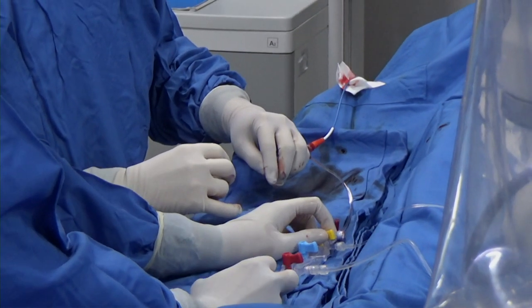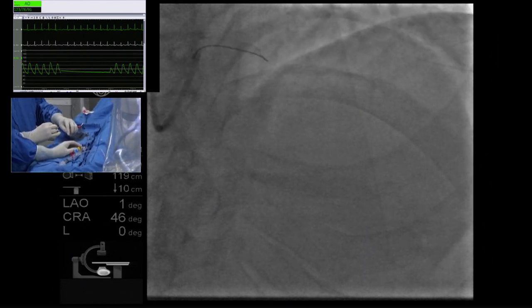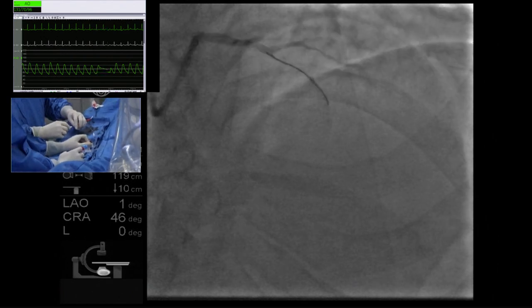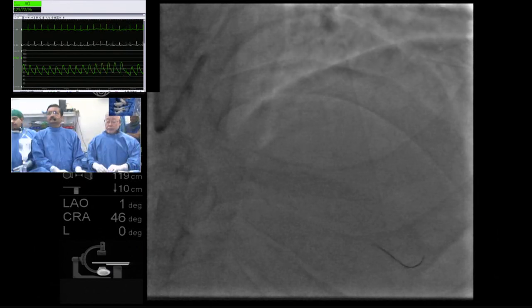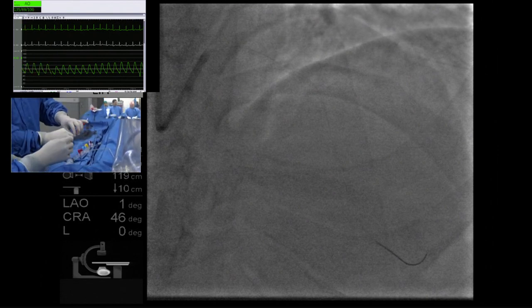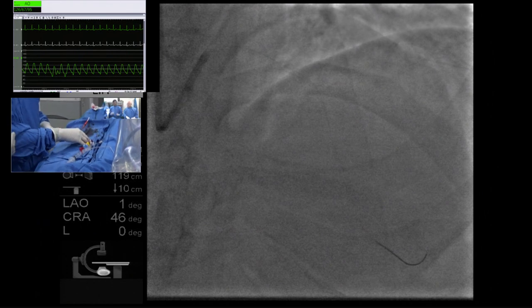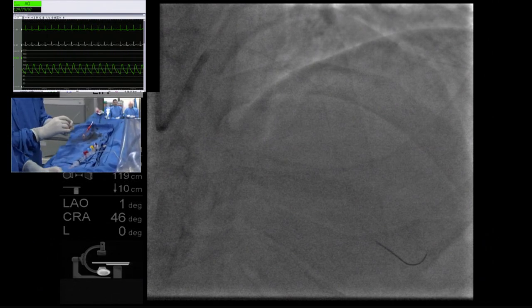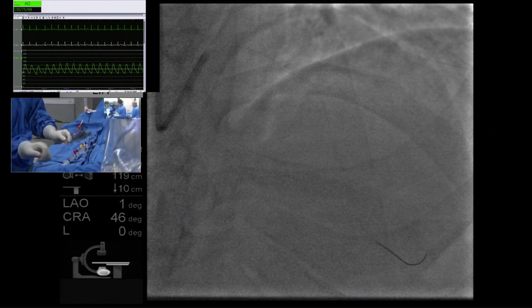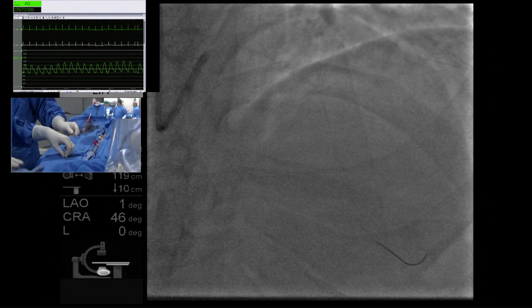Your thoughts on that? Yeah, I think you bring up a very important point, which comes down to guide positioning. The angiogram we know does not assess the left main particularly well because of the angulation of the vessel in respect to the aorta, which is why general practice now advocates the use of intravascular imaging. IVUS in particular has tons of evidence behind it in that scenario. But the key is that your guide catheter actually has to be coaxial, and it's not particularly good for length when you've got true coaxiality, because the guide catheter by definition is going to go back and forth with each beat of the heart. So when you're looking at length, you need stability of your system, but you're going to lose your cross-sectionality right at the ostium. That doesn't necessarily apply within the mid-shaft of the left main or the mid-shaft of the other vasculature, because it's not as susceptible to oblique cutting, given that aortic angles are different in different patients, and that's why the ostium is a specific area there.